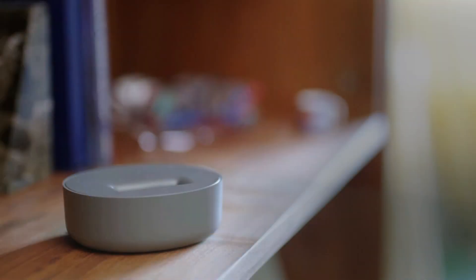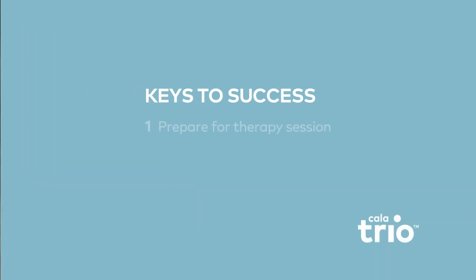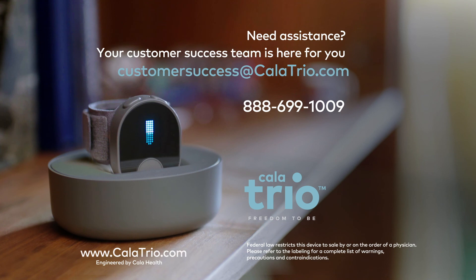Finally, remove the Calatrio by unfastening the Velcro strap and storing the device in the microfiber storage bag, or charging it in the base station. Congratulations, you're finished. Now you're ready to enjoy the benefits of your therapy session. And remember, anytime you need relief from your essential tremor, the Calatrio is there for you.